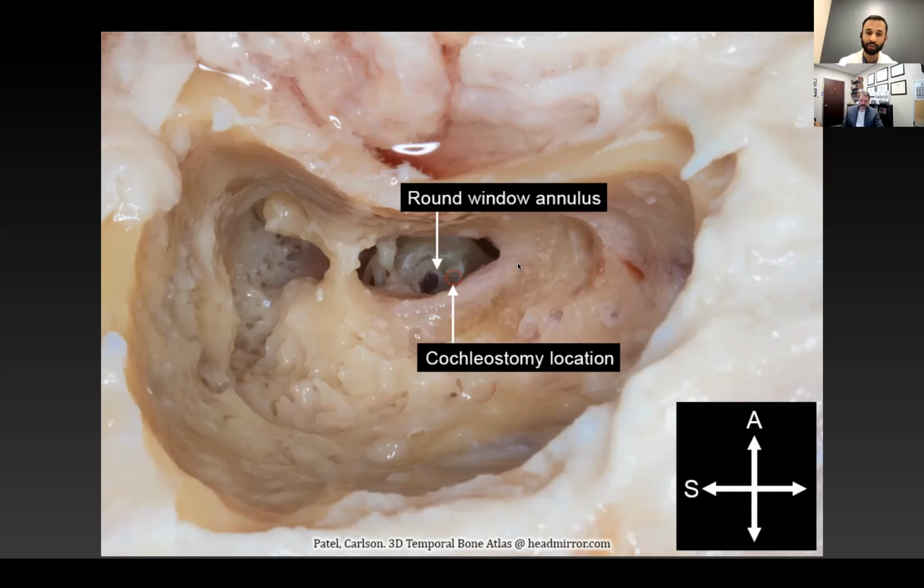The second thing, going back to opening the facial recess, that's important is the more bone that you leave on the facial, that seems like the safer thing to do, but ultimately it can very much create tunnel vision through the facial recess. So you're trying to get light into a 2 millimeter-ish by 4 or 5 millimeter triangular space with a microscope. And everything is line of sight on a microscope.